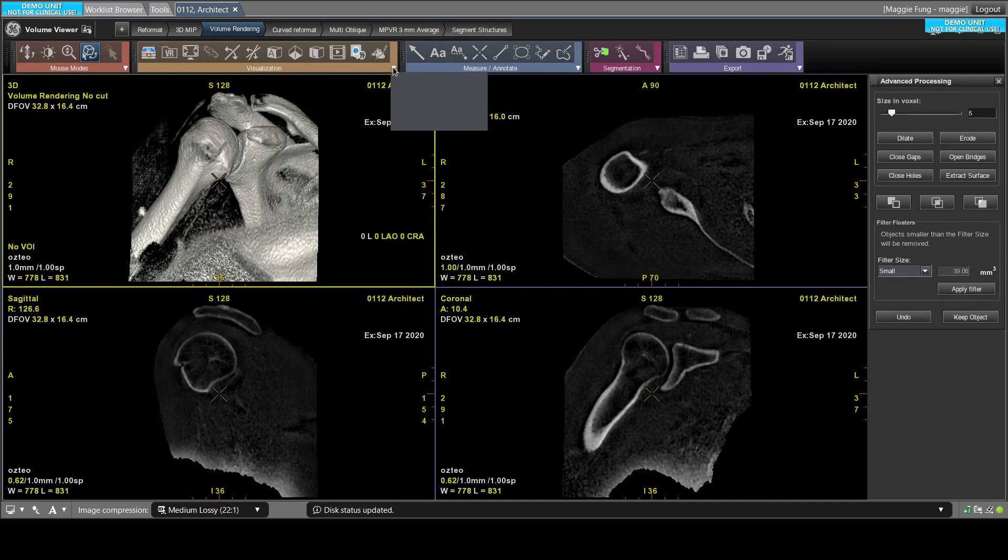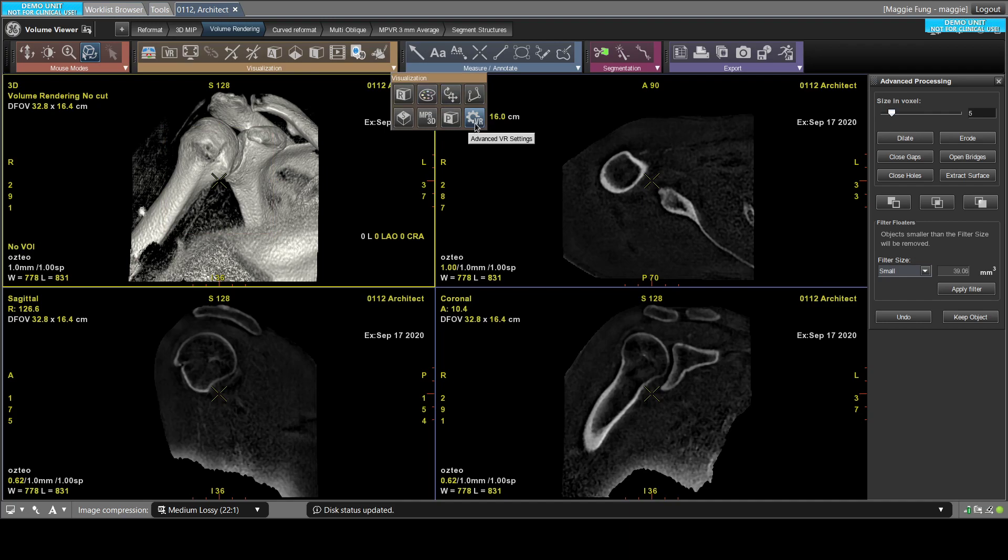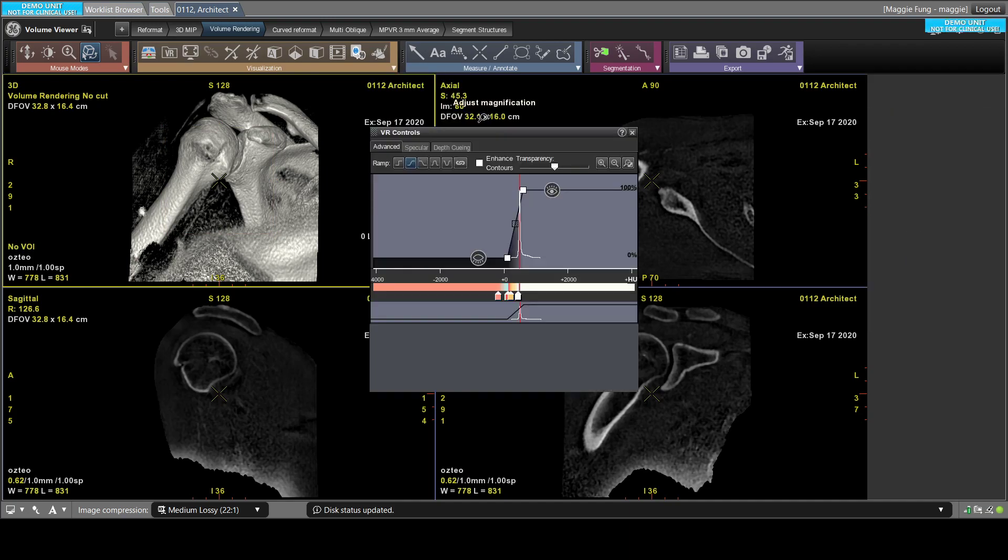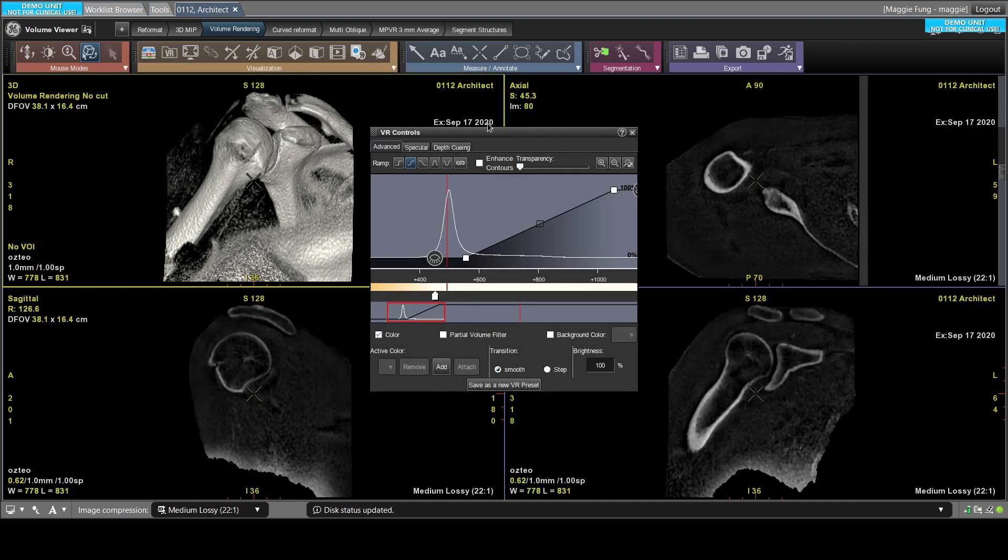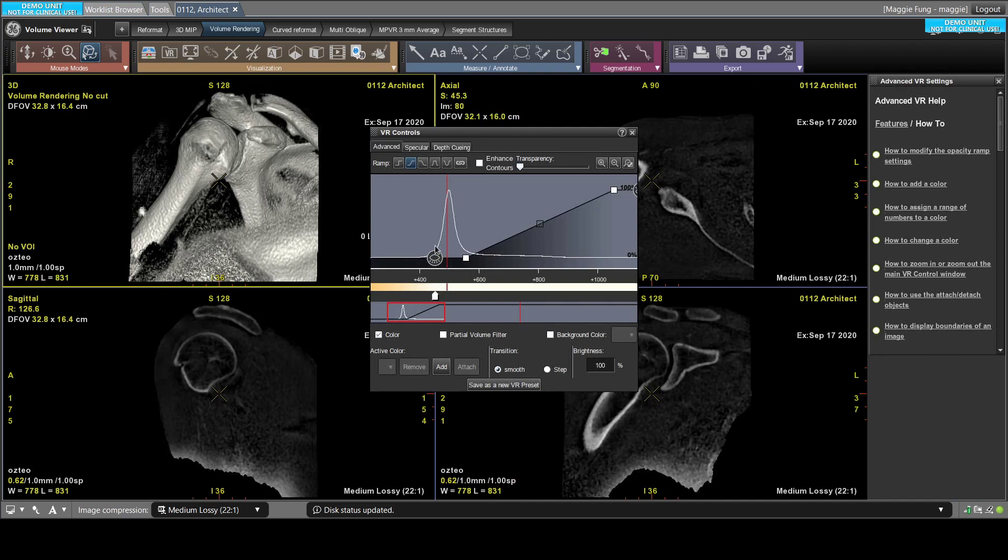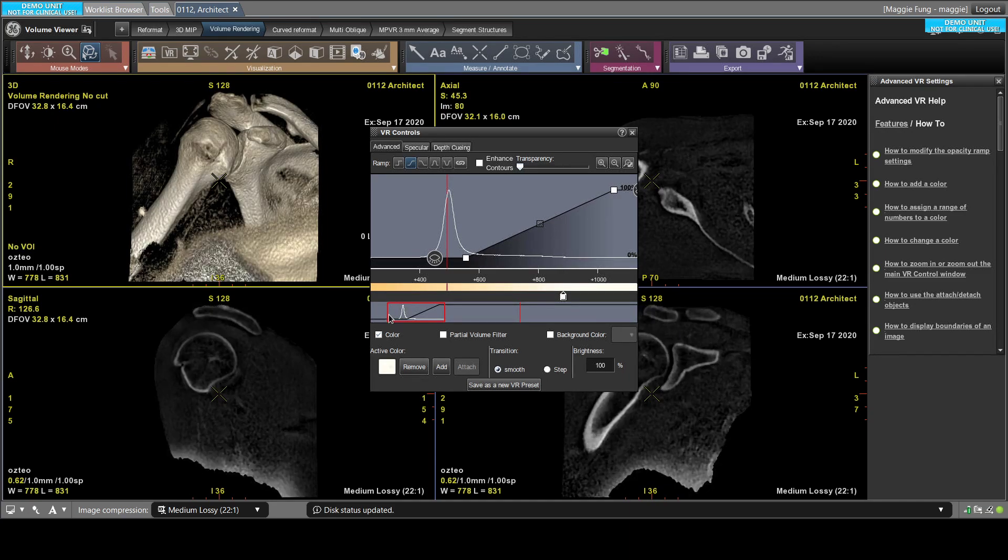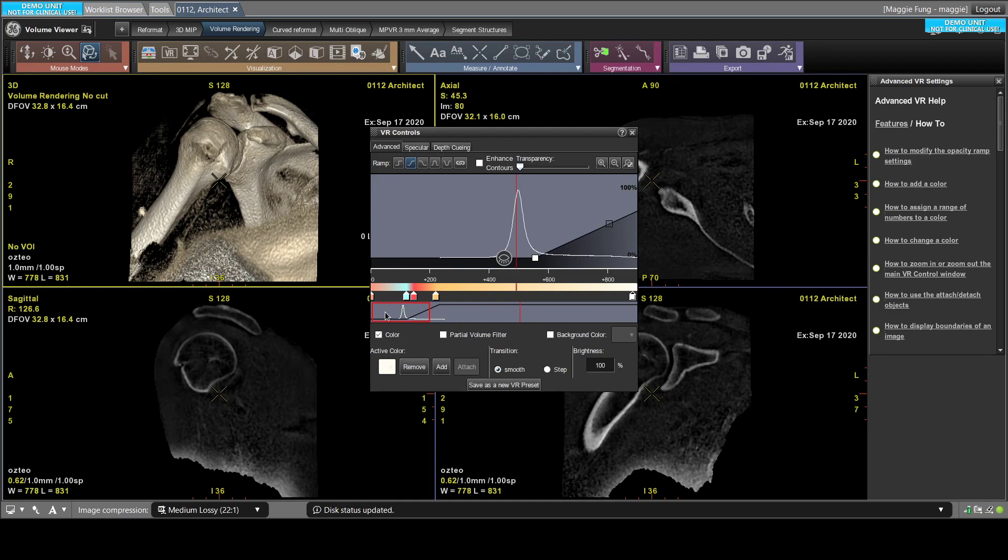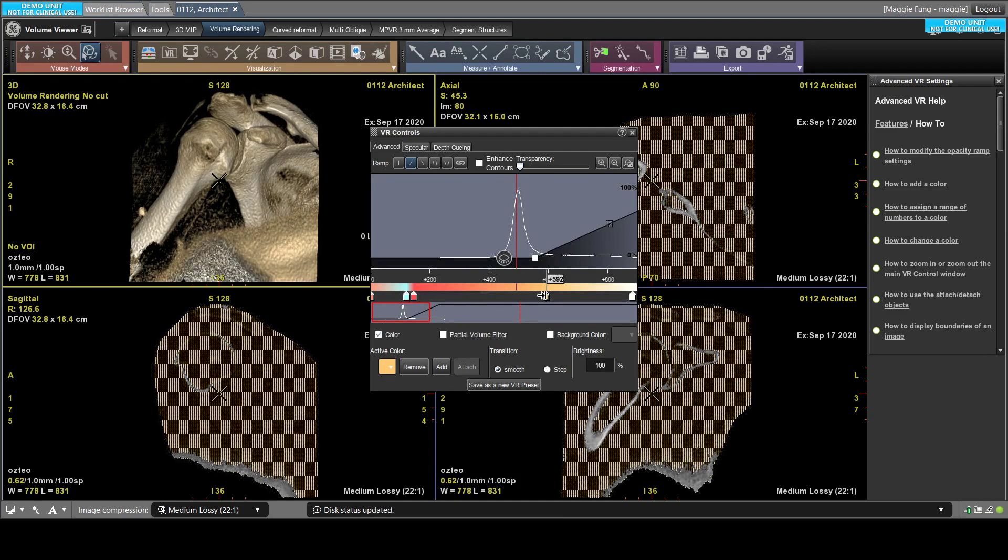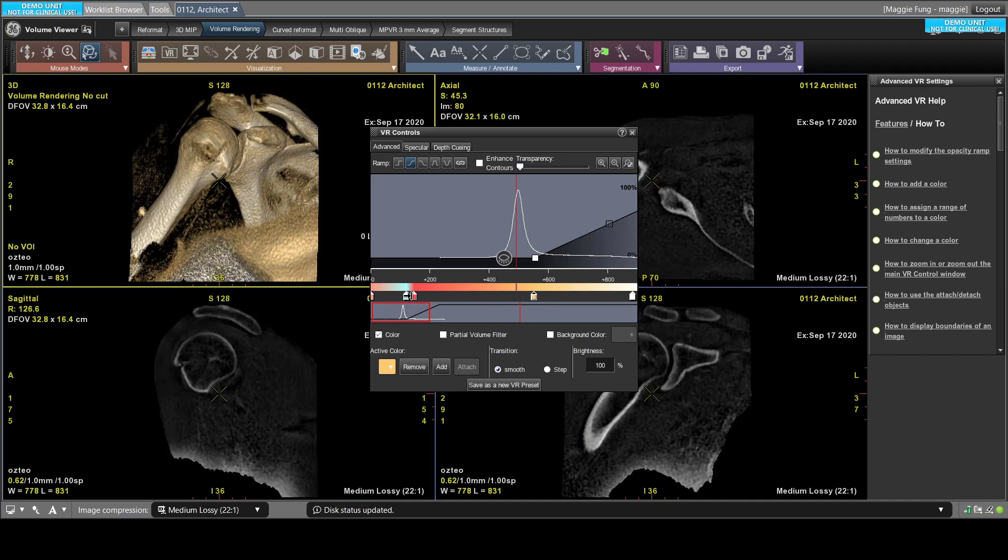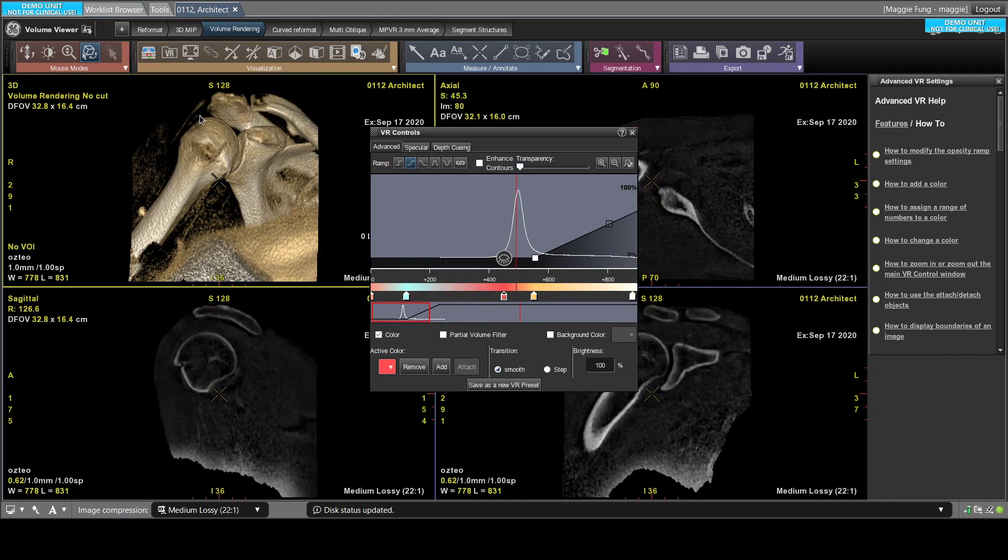So at this point, I will also change the color using the advanced VR settings. So usually for ZTE sequence, you get a nice peak here. You try to adjust your color a little bit. Usually I just adjust the first three colors and that's usually giving me a pretty realistic view of the bone.